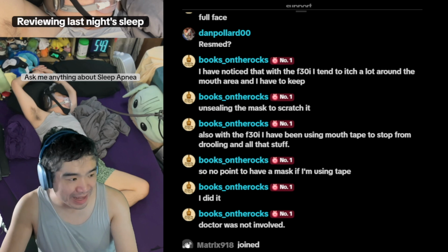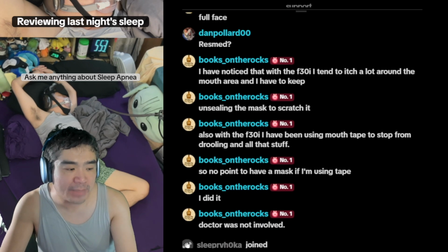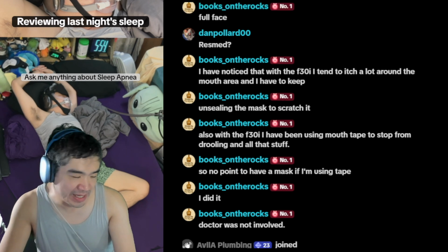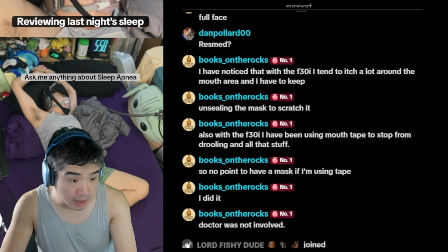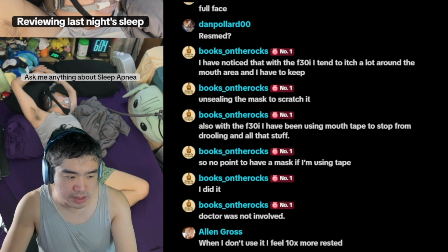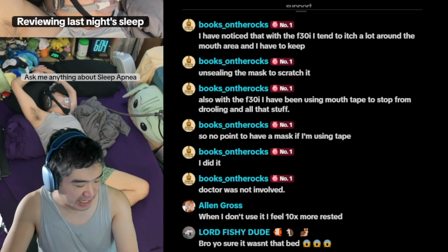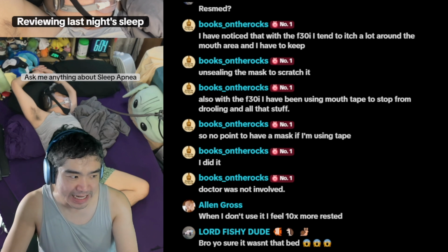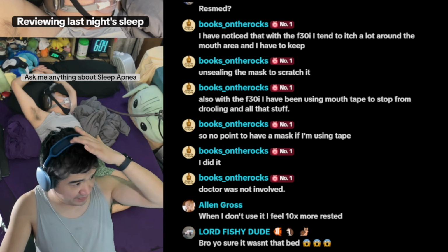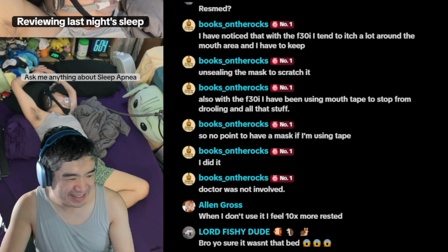So yeah, that's the nasal mask and mouth tape. I would say that was maybe the only situation where mouth taping might work, and that's a whole big maybe. Now that you're getting the nasal mask, it's up to you to try it. Just be careful. When someone was fact checking mouth taping, they say you don't necessarily have to use tape that's not breathable. Apparently, there's some breathable mouth tape, probably Feature Made. They probably sell it for some ridiculous markup on Amazon, and it's like, oh yeah, I pay how much for a piece of tape I'm gonna put on my face one night.